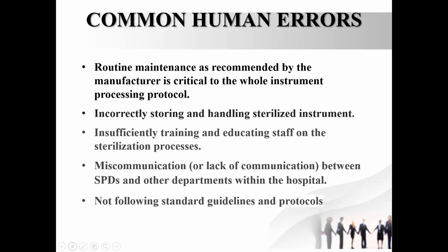More common errors. We are not doing the routine maintenance of our sterilizer as recommended by the manufacturer. This will be done by our in-house team of engineers, medical engineers or biomed engineers as we call them. Okay, regularly routine maintenance has to be done. Then sometimes we don't store the sterilized instruments properly. We make them wet or we mishandle them.